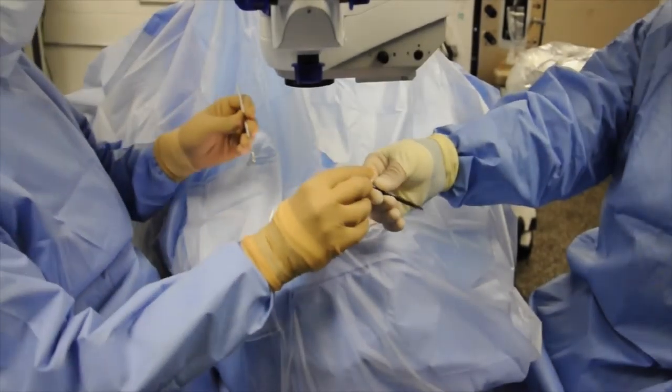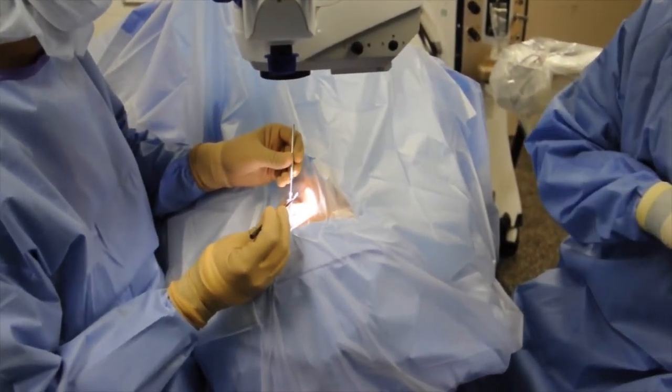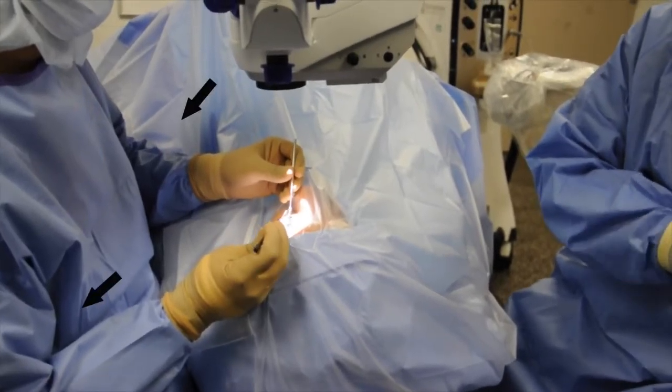In preparation for surgical gonioscopy, several factors need to be taken into consideration. Note that the coaxial light is perpendicular to the surgical field, the patient's head and body is in a supine position, and the surgeon's elbows are straddling the flanks.